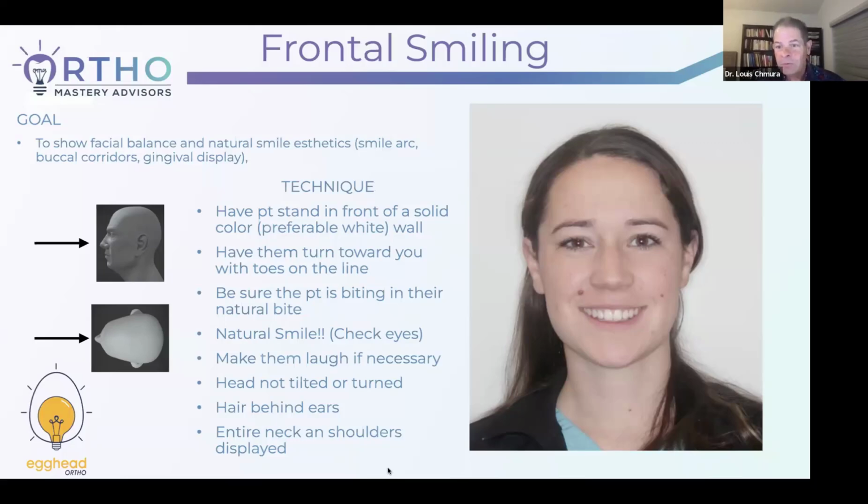And again, pretty much this is where you want the camera to be. You want to fill the screen like this. You want to see from the top of the head down to the clavicles. And there's anatomy that makes a difference all the way along there.